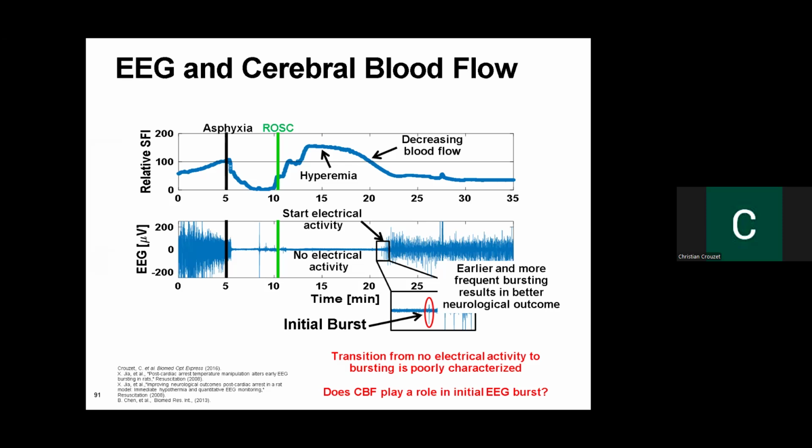At least for the OCTA part, I think the visualization of vessels is good. The actual flow information, sometimes there's not a match, and I don't know how to merge them or make them synergize well.